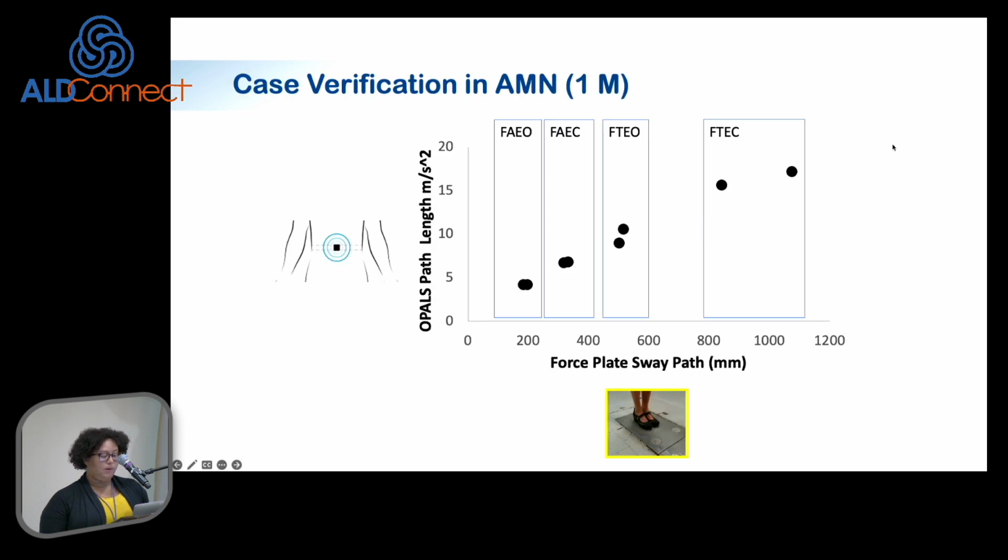Okay. So there's been a lot of encouragement recently from the FDA to use the force plates for sway measurement. So we were pleased basically to get these findings with the wearables. This is early. We definitely need more patients to participate, but it looks like they are showing some promise as an additional, maybe more flexible measure to use in future clinical trials.